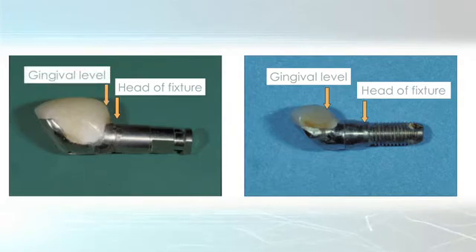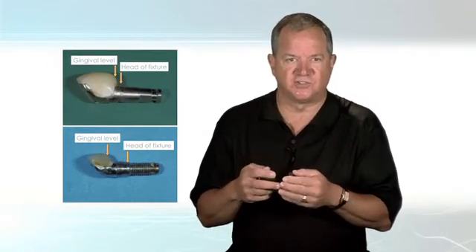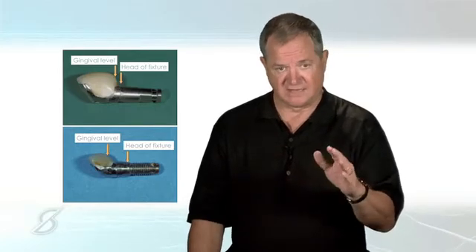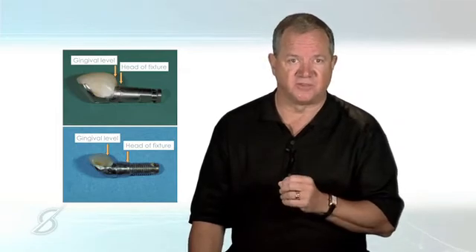Now, obviously that's what looks like a pretty severe emergence profile. Interestingly enough, in my experience, implants that are a little palatally placed actually do really well in terms of long-term gingival stability. So that emergence profile that is somewhat steep really doesn't bother me.